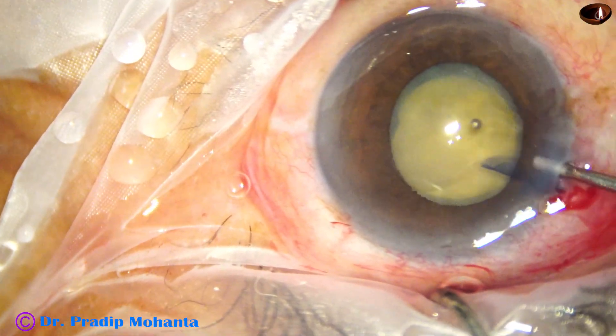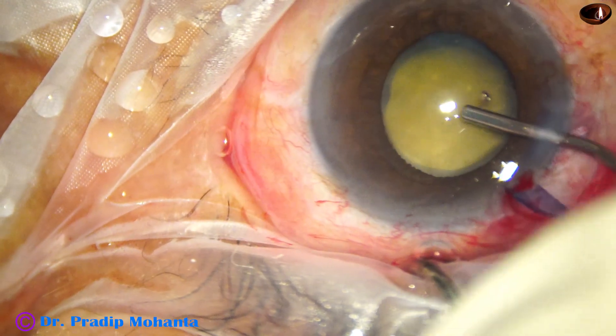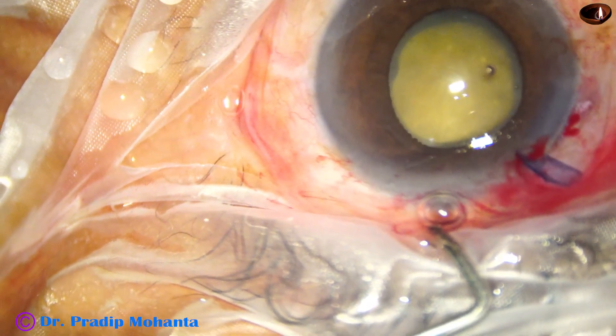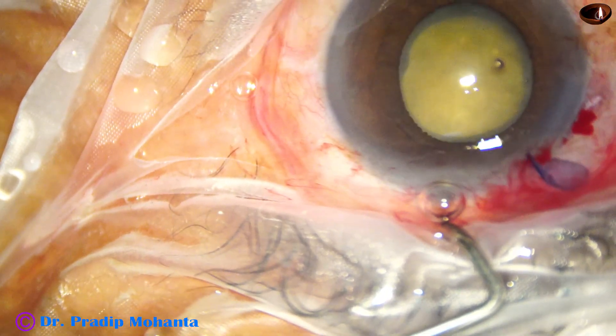The main wound, which was 2.8 mm, is enlarged to 3 mm.